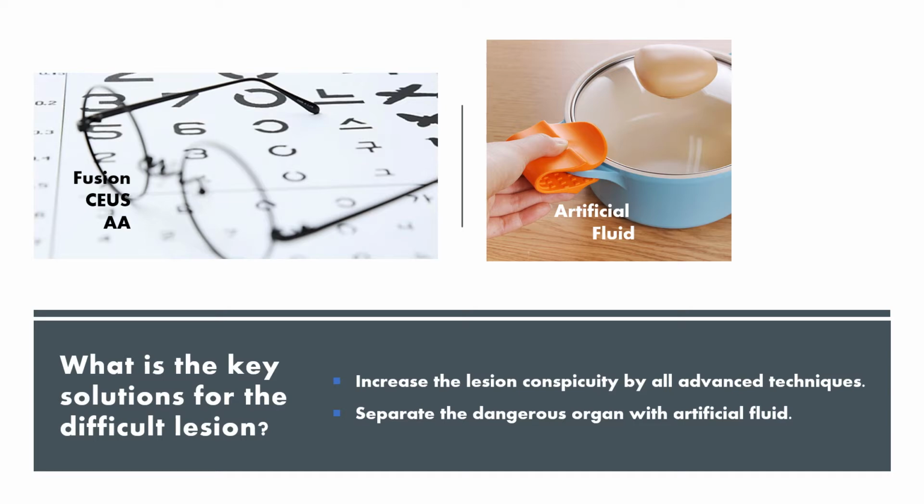What are the key solutions for the difficult lesions? First, I would say we should improve the lesion conspicuity, which can guarantee the accurate placement of the applicator by all advanced techniques. Second, we should separate the dangerous organ from the potential ablation zone by means of artificial fluid.